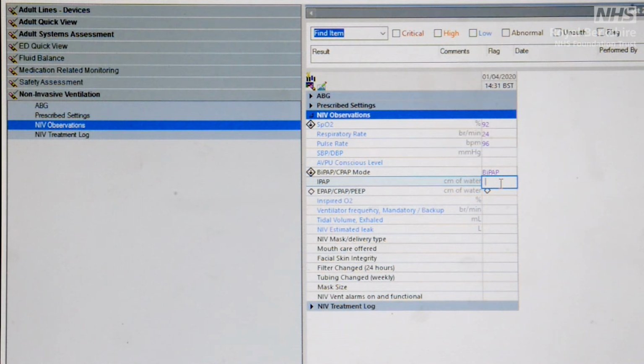You need to go back and look at the screen on the Trilogy to determine what the patient is actually achieving. I'd previously set that I wanted the machine to deliver 10. Currently, my patient is struggling to achieve this, so at the moment I'm just going to record that the patient is actually achieving 9.